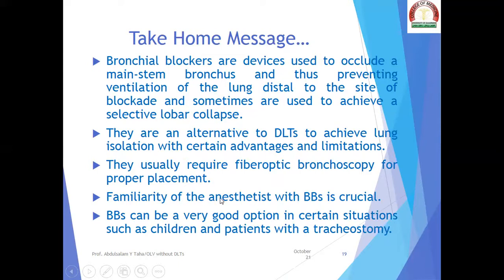Familiarity of the anesthetist with bronchial blockers is crucial. Bronchial blockers can be a very good option in certain situations, such as children and patients with a tracheostomy. And actually, the next lecture will be devoted to one lung ventilation in certain situations, such as patients with tracheostomy and difficult airways.